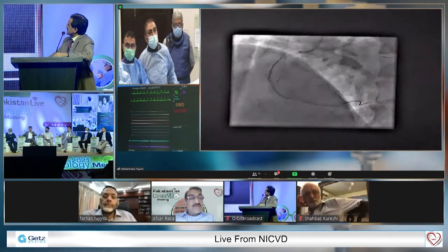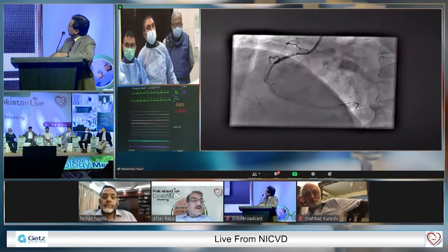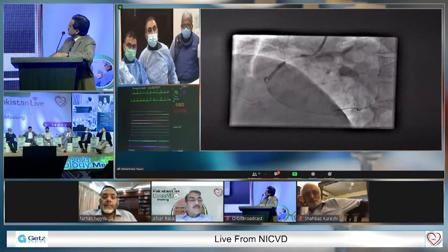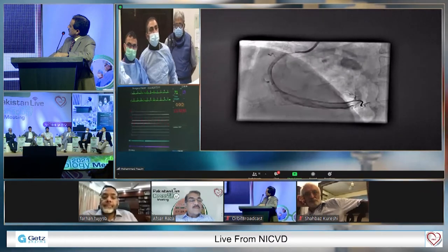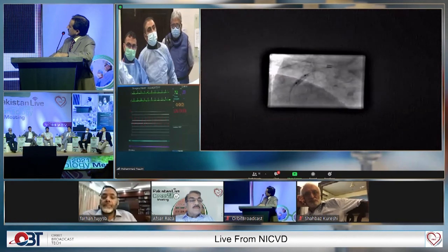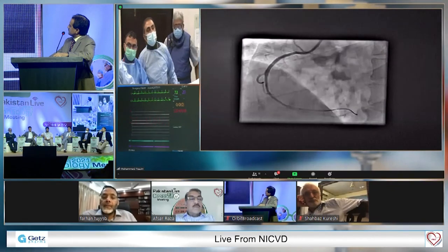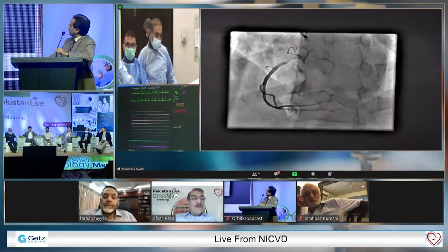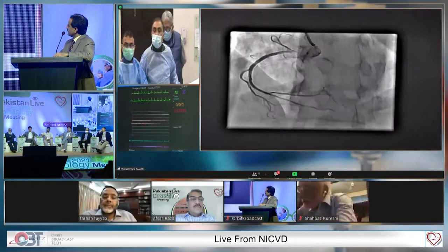Can you just show us the next clips, please, Naeem? We can't hear you, but just keep showing us the clips, please. Next, please. Next. Seems to be a very good result. Did you post-dilate this? Okay, they did. Yeah, a lot of times if you really try to post-dilate, that's when you get no-reflow. So that's where we quite judiciously use nipride and adenosine vasodilators to open up the distal bed to prevent no-reflow.